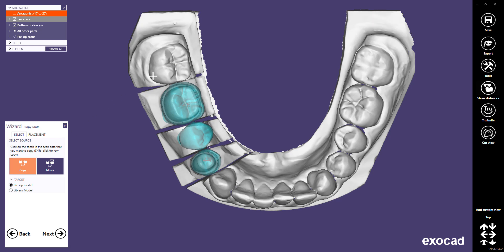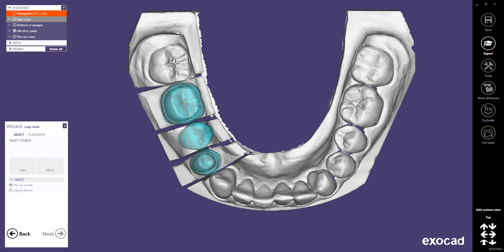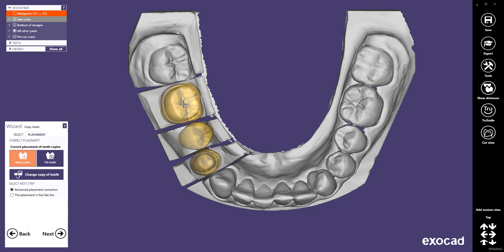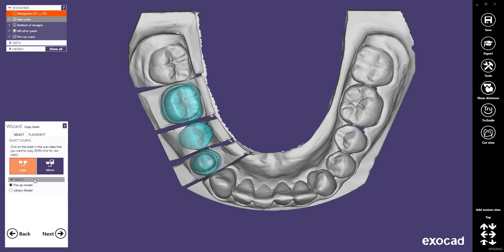Let's try to copy a tooth from the same quadrant. Once you have selected another tooth, click the copied tooth you want to replace. Let's repeat this operation to mirror the opposing tooth again, as a mirrored tooth number 6 looks better than a copied number 7.